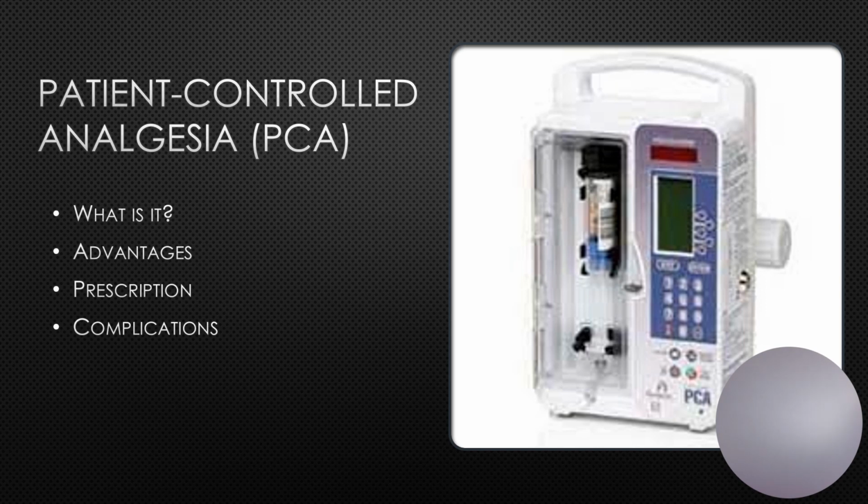We do double checks with the second nurse with PCA administration whenever we start a new PCA pump, we change the dosage or the lockout interval, or we replace a filled medication container with a new one.